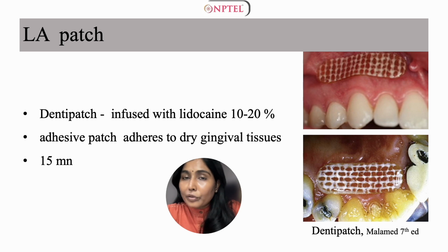The other novel form of local anesthesia delivery topically is the local anesthetic patch. A patch contains 10 to 20% of lignocaine. This is placed on the dried mucosa for 15 minutes. The patch is recommended for use in achieving topical anesthesia for both maxilla as well as mandible.